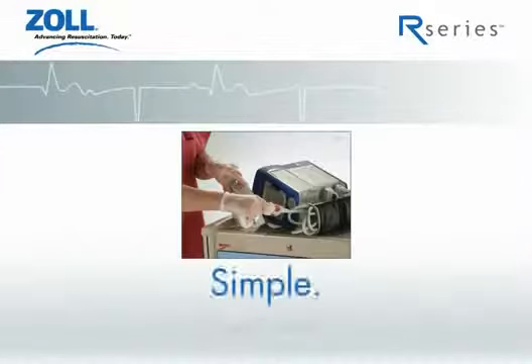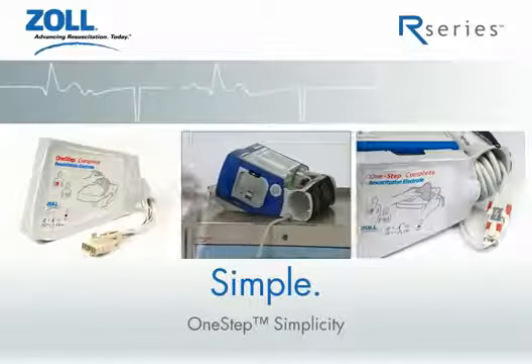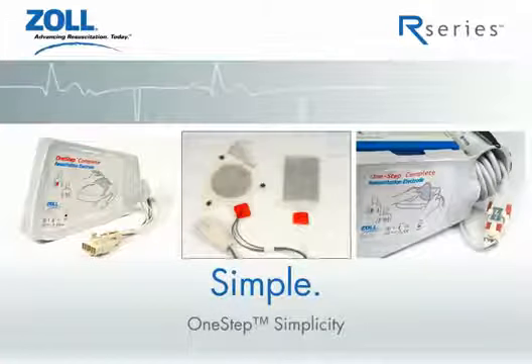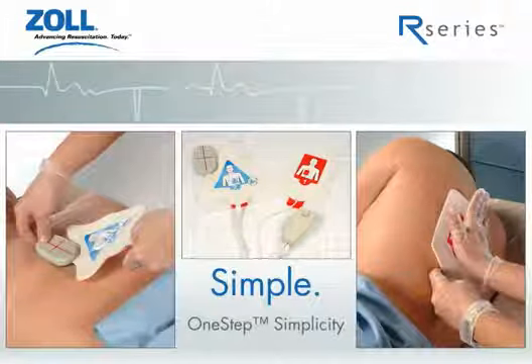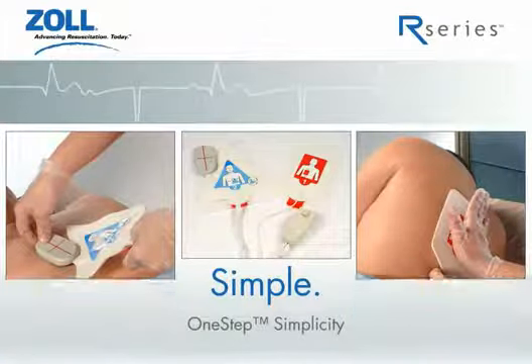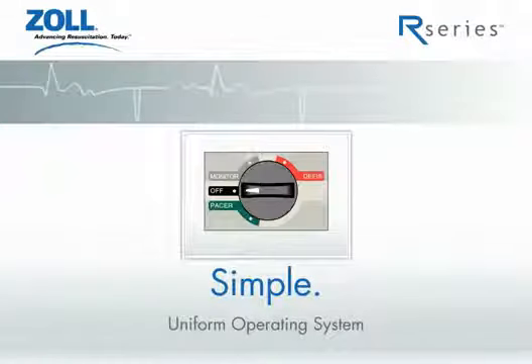Simple starts with a one-step cable. Simple continues with a one-step electrode that is stored on the defibrillator. And thanks to built-in ECG electrodes, you can now pace your patient without attaching a separate 3-lead cable. Most importantly, simple continues with Zoll's Uniform Operating System. All critical functions begin with this one main dial, and the functions are color-coded for ease of use.